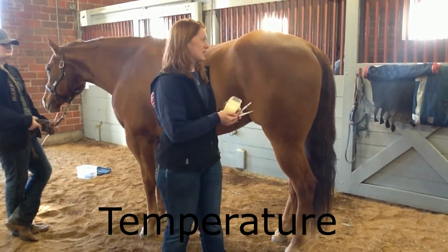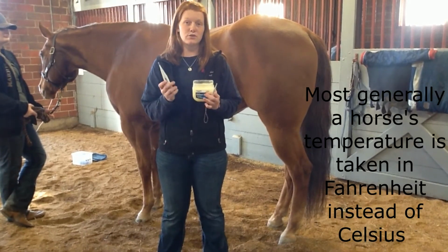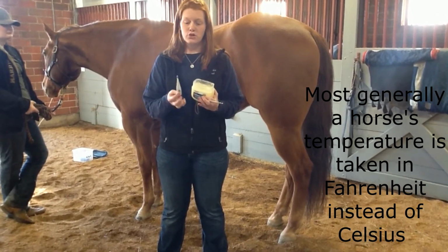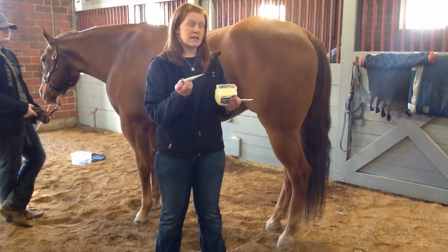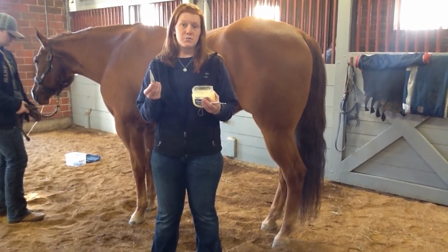So the next vital sign I'm going to demonstrate is taking the temperature. Whenever you're taking a temperature, you can either use a digital or a mercury thermometer. I'm just going to demonstrate the mercury today. With a digital thermometer, you're going to want to cover the end of the thermometer in Vaseline, turn it on, and insert it the same way as you would insert a mercury, which we will get to in a minute. And you will just listen for the beeper to go off.